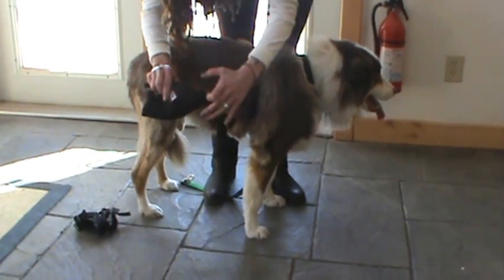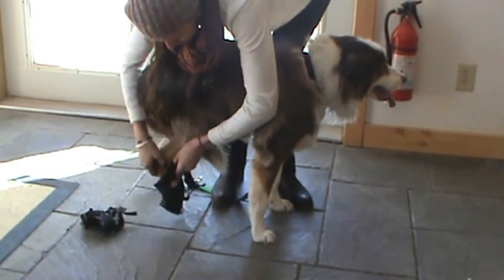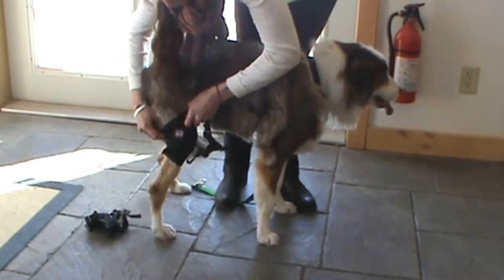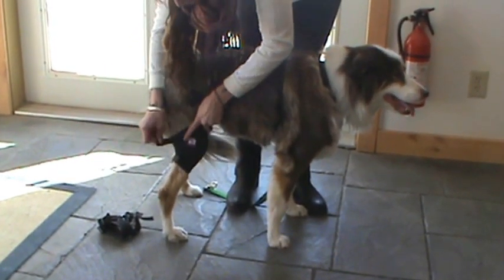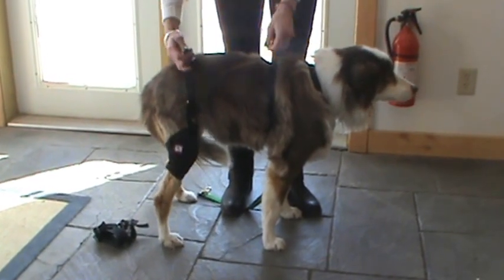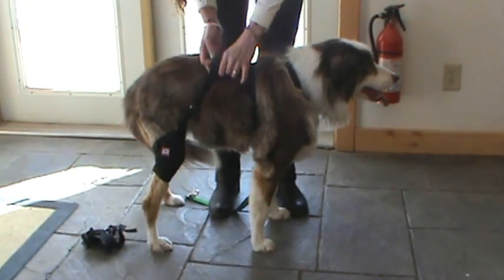Now you just slip your dog's foot into the sleeve. It shouldn't be too snug. Pull it up, secure the Velcro again, and take the elasticized webbing and go ahead and hook that to the harness so that it's easier to put the cuff on the other side.